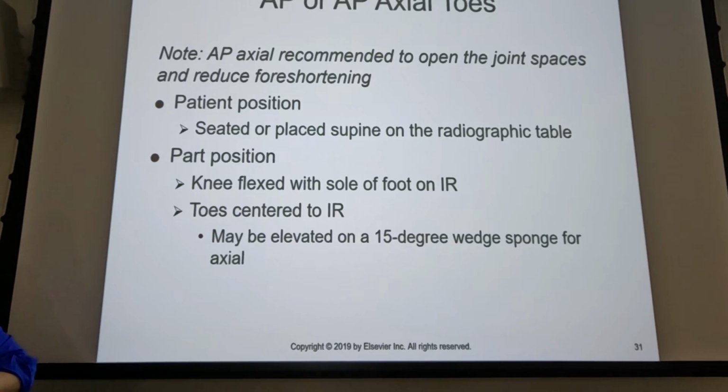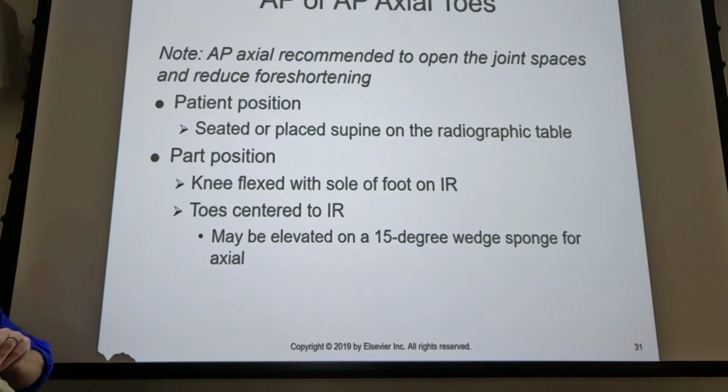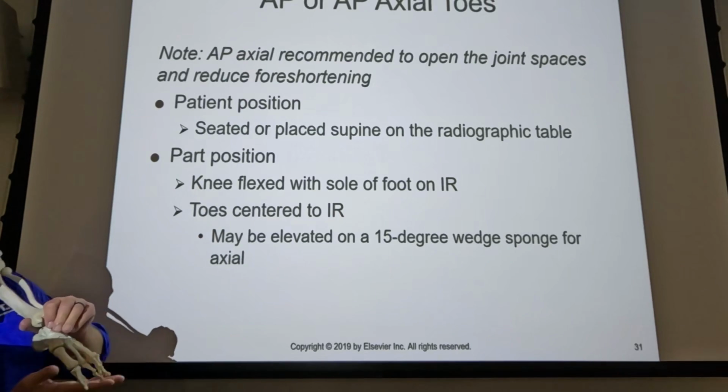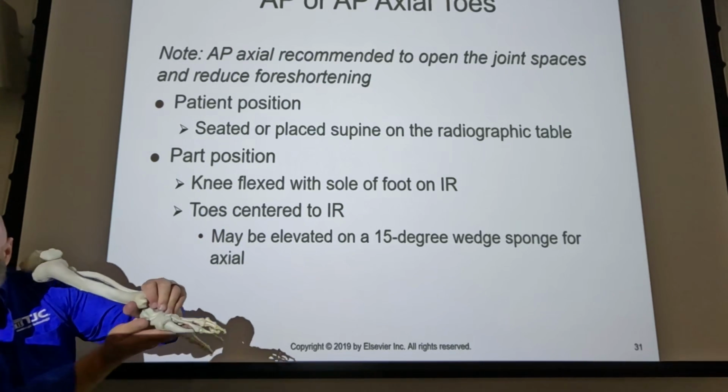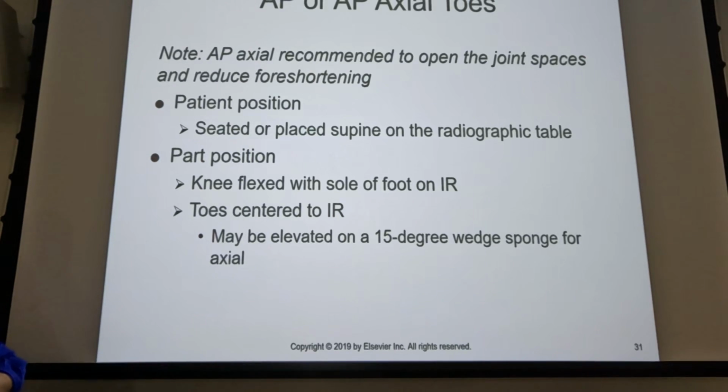Doesn't take anything to make it slide. So skin on plastic, you've got a little bit of resistance there, right? So if you bend the patient's knee up and you put the light on the foot, you collimate it properly. Before you step back to make the exposure, hit that collimator light one more time so it stays on while you go back behind the control panel. Take one last look and make sure that they haven't scooted the image receptor and their foot out of the light field. Take one last look before you make your exposure.